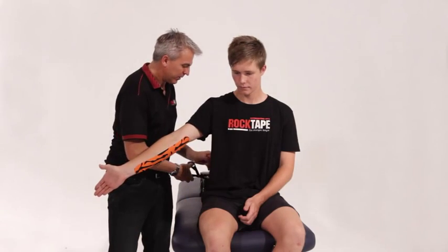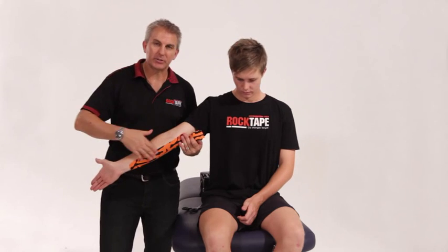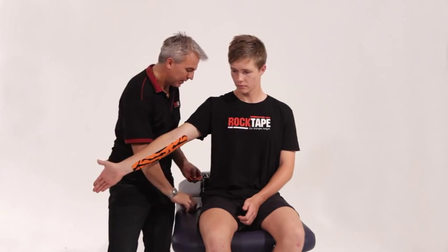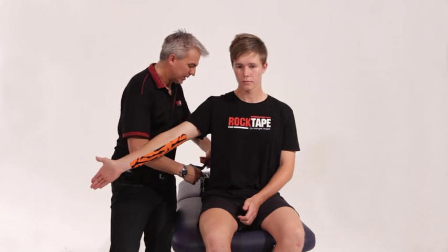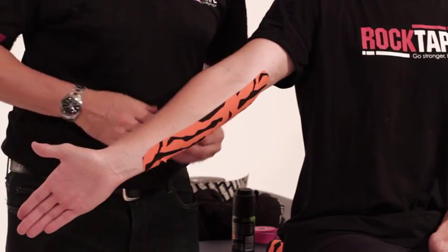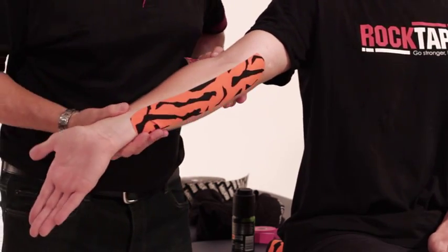When we do the decompression tape — this is a stabilisation tape, that was step two — step three is doing the decompression tape, and that is also going to go over the sore part of the elbow. A lot of times it's just in here. Just roll that arm a little bit for us, Ryan.